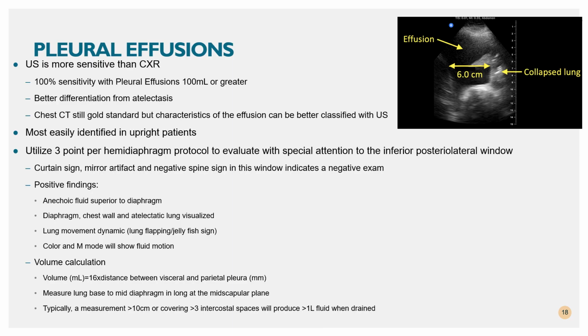So obviously you can go through some of those charts and graphs and some of the algorithm more thoroughly, and let me know if you have any questions. But I know this is what you guys do, so I'm sure you'll be able to implement it into practice with little to no issues.